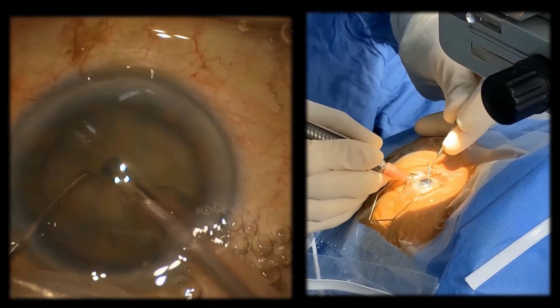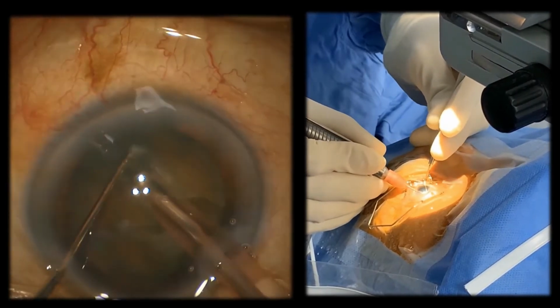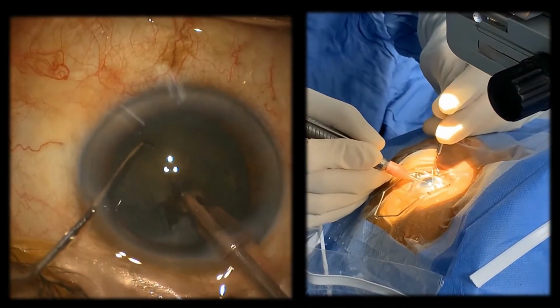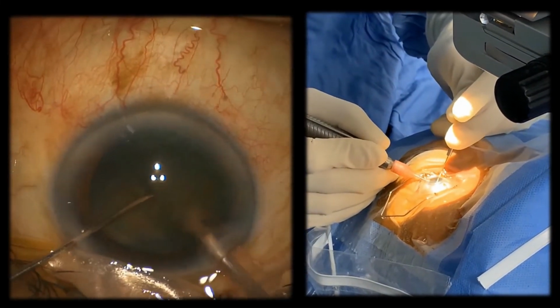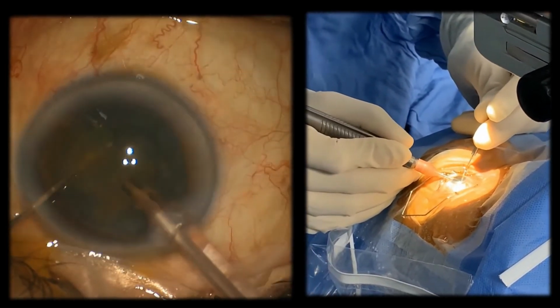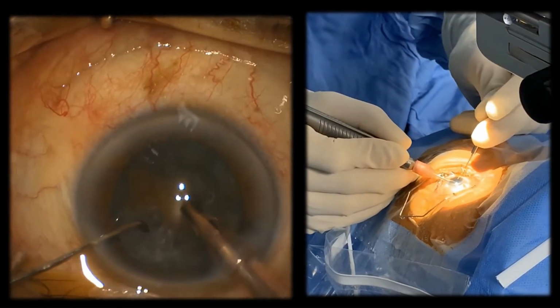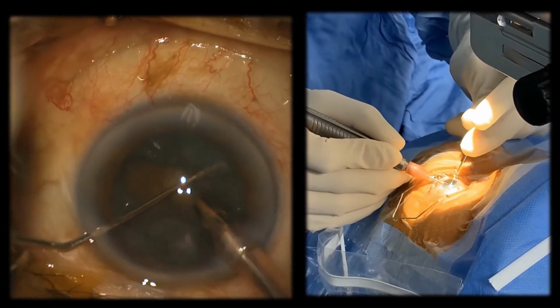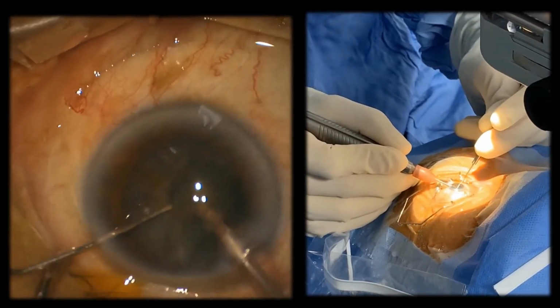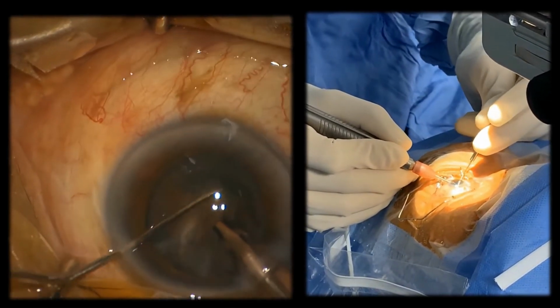The type of phacoemulsification method used depends on the density of the nucleus. Note that the phaco probe is held by the right hand, and the hand is actually supported by the ring and little finger, which rest on the extreme corner of the patient's forehead, very near to the temporal part of the head.